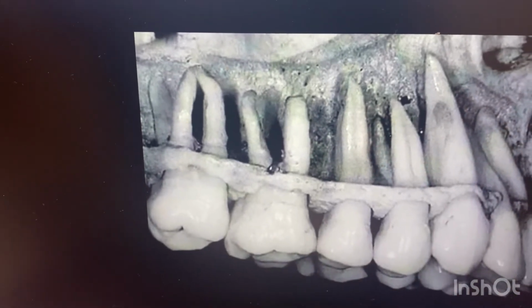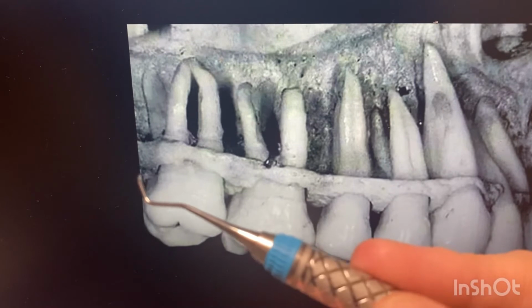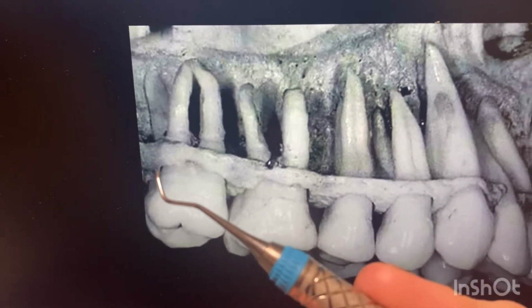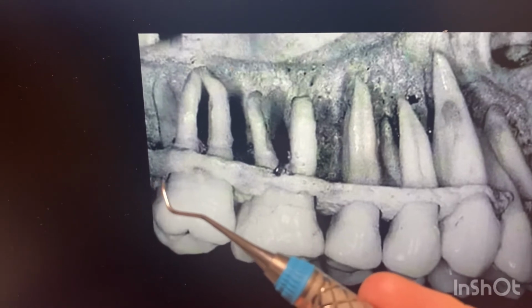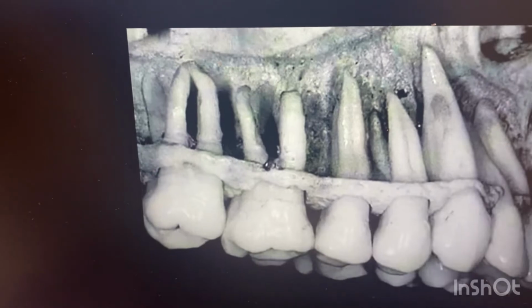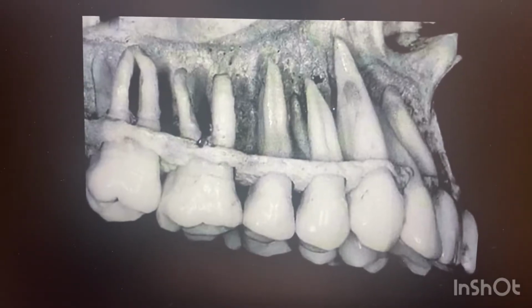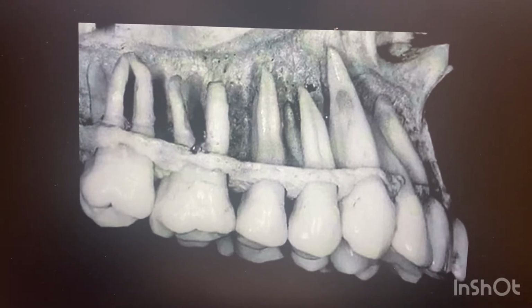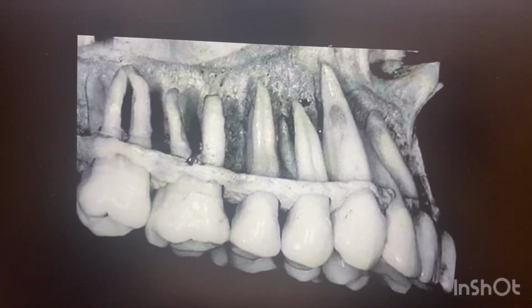So we are going to switch to the other side, and we can see that the terminal shank now is parallel to the tooth that we are working on. And so we have found the correct working end. We are going to fulcrum against the occlusal or incisal edge of the teeth and adapt the toe third of the cutting edge against the tooth.